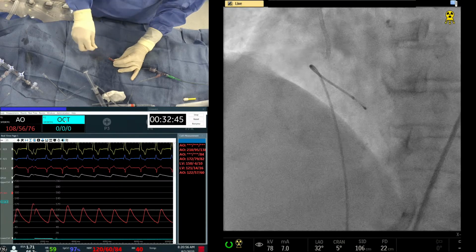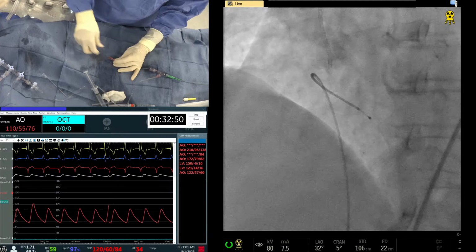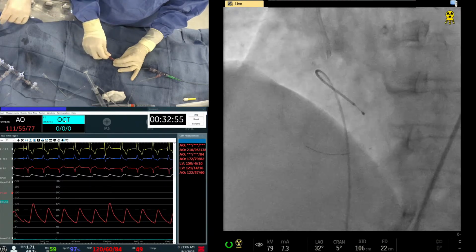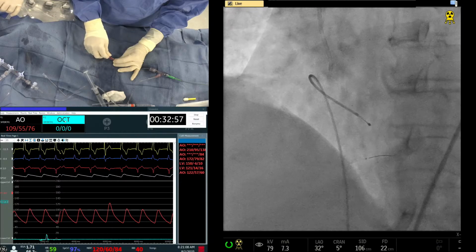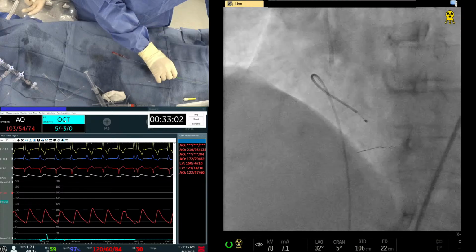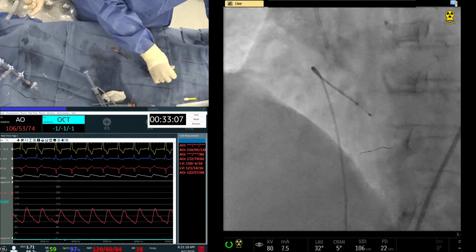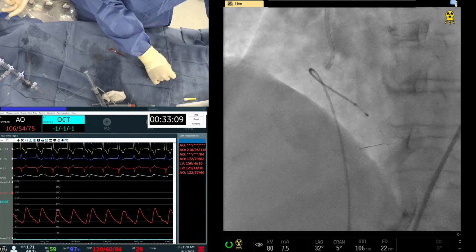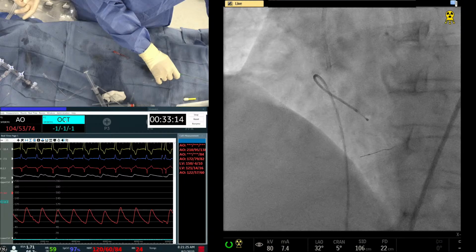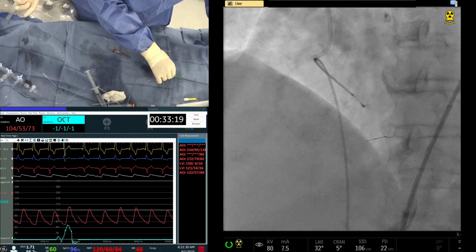I think we did not put the picture of the catheter itself. And you're exchanging for which wire now, Dr. Kennedy? It's a Rota floppy wire, but I'm more worried about the guide. You see that? We may have to go back with the right Lima guide. That clearly was sitting well in the initial picture, but okay. I think that's better now. Yeah, good, nice. Now it's better.